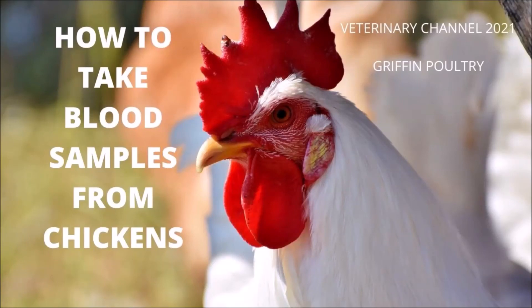The following video is a collaboration between the Veterinary Channel and Griffin Poultry. In this presentation we are going to show footage of how to take blood samples from chickens using the brachial vein. We begin the video by briefly giving you some talking points about the circulatory system of chickens, then show you footage courtesy of Griffin Poultry about how to take a blood sample using the brachial vein of several chickens.